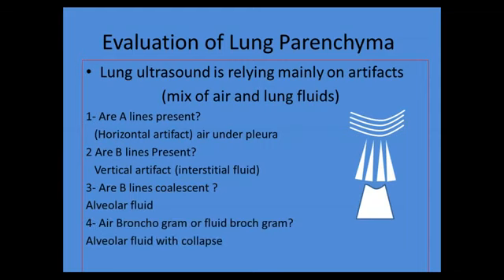And at the end, we may have air bronchogram when the lung inflation does not exist and there's almost a collapse. So you can see just the air in the bronchi on the fluid background or collapsed background, and this condition we call air bronchogram, and I will show some examples for that.